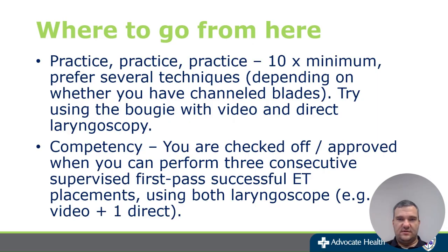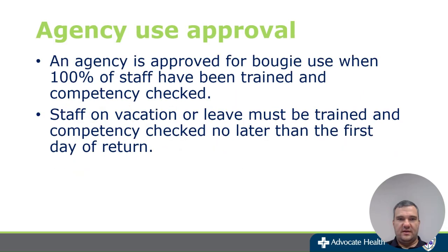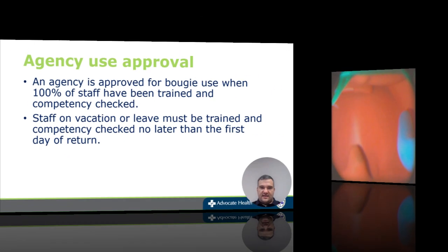As far as competency goes, you'll be checked off and approved when you perform 3 consecutive successful first pass placements using both video and direct intubation techniques. And then as far as an agency, you'll be approved when 100% of your staff have trained and checked off. Obviously, if people are on vacation or PTO or things along those lines, they will need to be tested and trained on their first day of return. So that is our refresher.